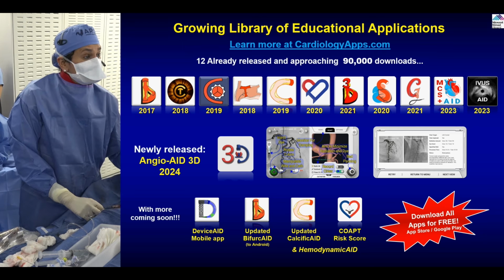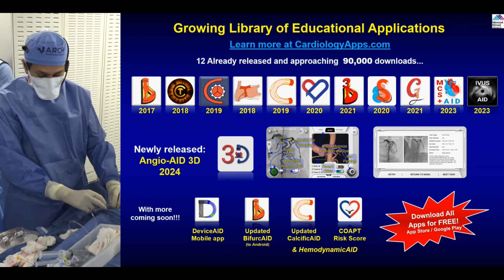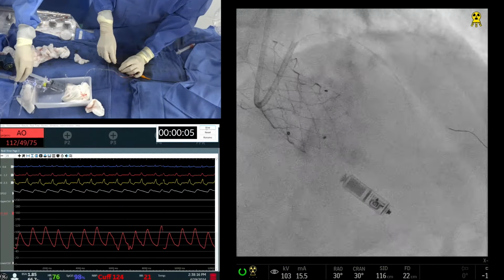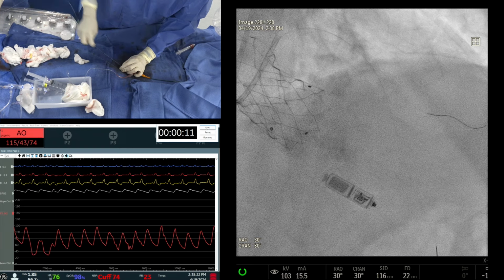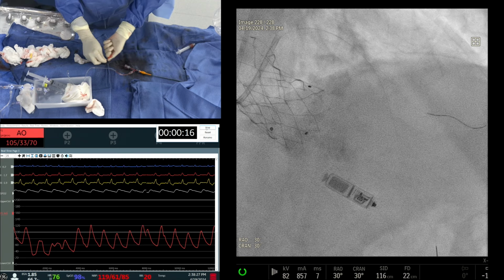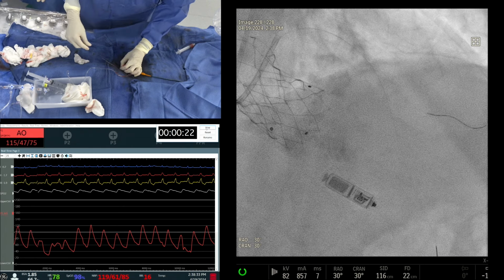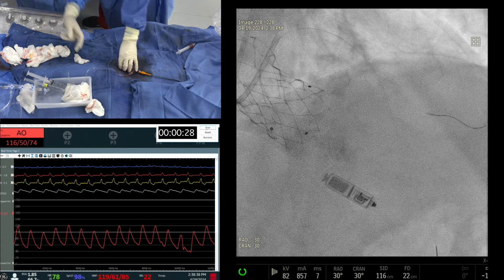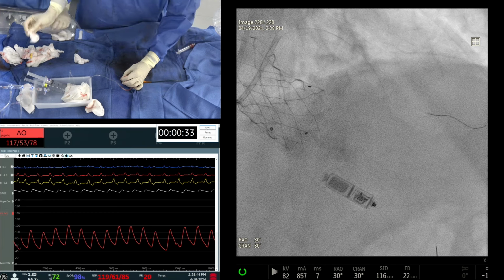So we have some demonstration of the bifurcate side by side and the provisional stenting. Ready? Done? I don't think we have to take a picture, right? We have to go to the side branch and dilate it. 2.5 non-compliant now. The concept is that we have done IVL and we just want to make it a little smoother with a 2.5 non-compliant balloon, and then put a stent across. So provisional is the one we are aiming for in this particular case.